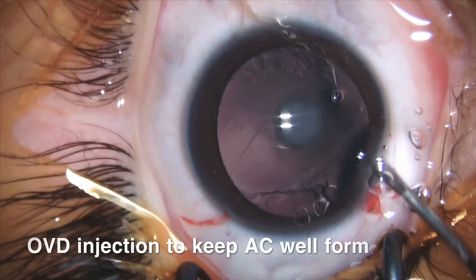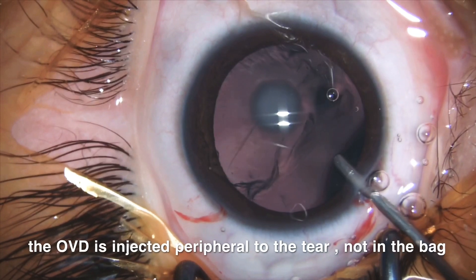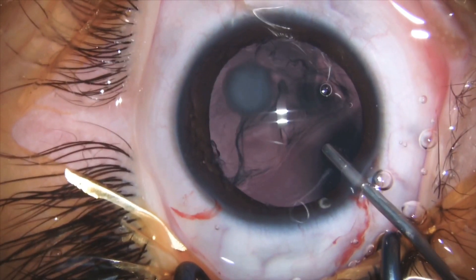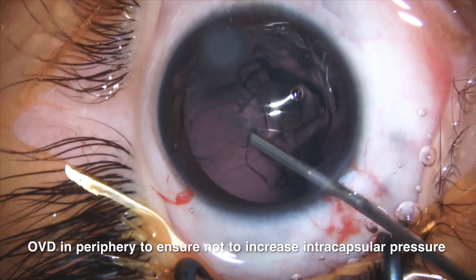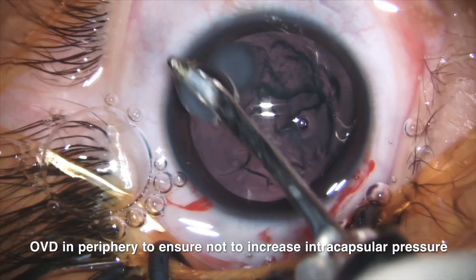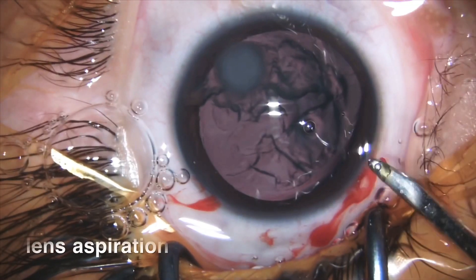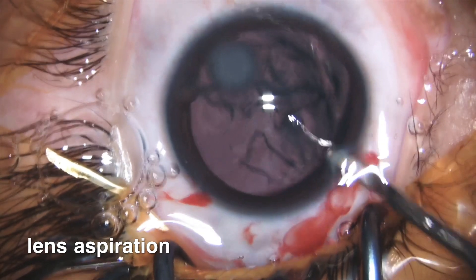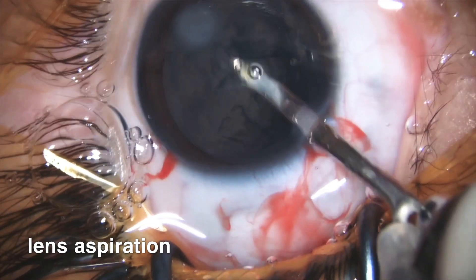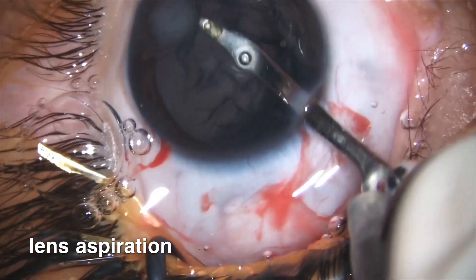Now what to do? Let's begin OVD injection to keep the AC well formed. We have to remember that always when there is a radial tear or capsular extension, we have to inject OVD peripheral to the capsular tear to ensure not to increase the intracapsular pressure.